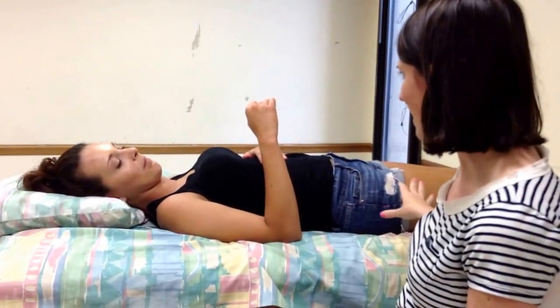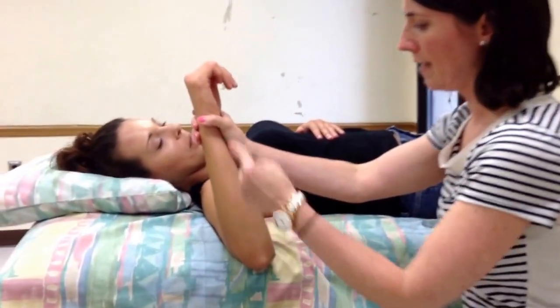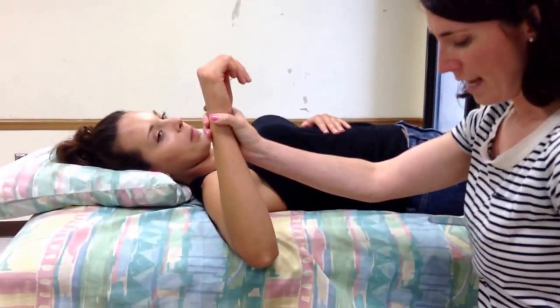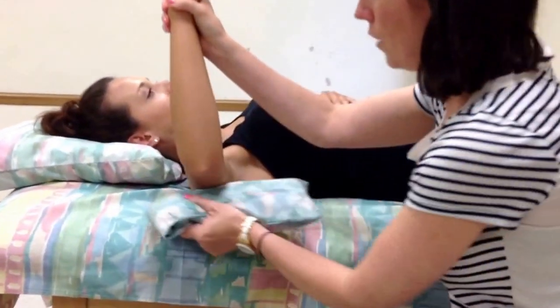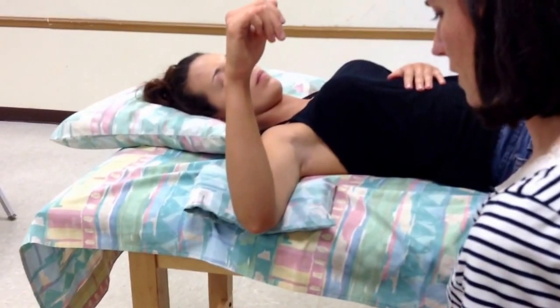The patient is going to be supine in the bed. She's going to have 90 degrees of shoulder abduction and 90 degrees of elbow flexion, and then we're going to put a little towel roll under her distal humerus so that her humerus is parallel with the ground. So I want you to hold your arm right there.